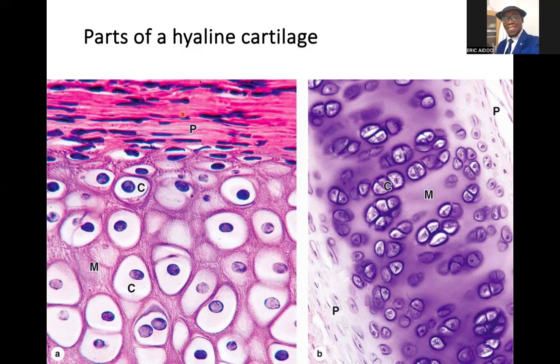So that is the perichondrium, which means that a similar structure like the perichondrium will be found on the other side of the cartilage if we extend this downwards, but this has been truncated. So you are only seeing just portions of the inner region. So we are traveling from here, which is the outermost portion, and then getting inside. So the P stands for perichondrium.